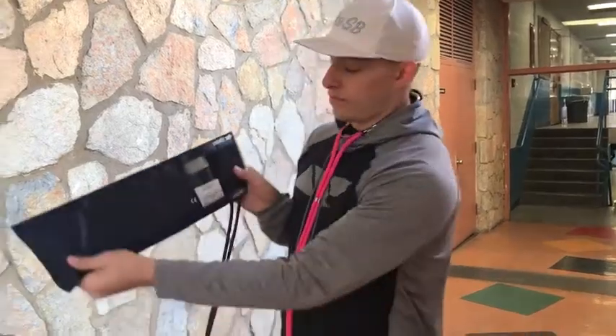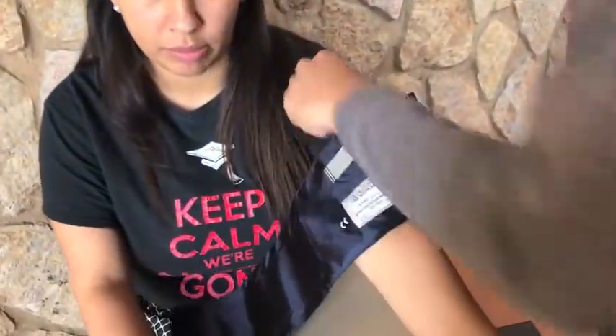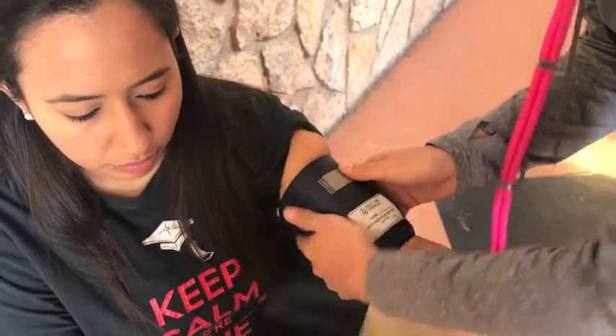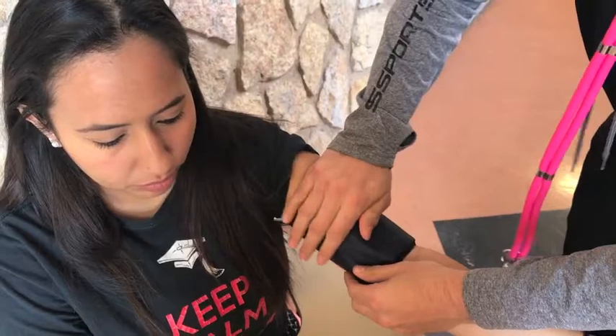To begin, identify the artery mark on the cuff and align it with the brachial artery on the subject. The bladder of the cuff should cover at least 80% of the subject's upper arm. Make sure the cuff is wrapped firmly around the arm of the subject, but do not cover the brachial artery.